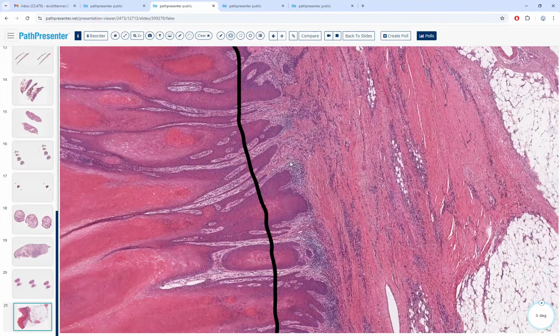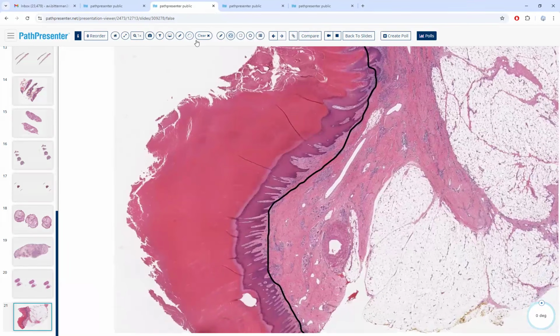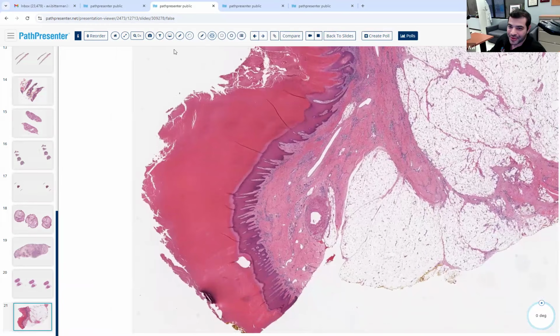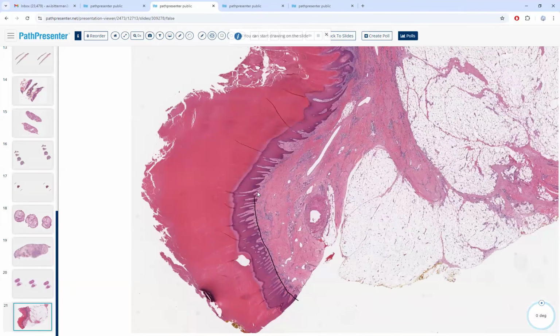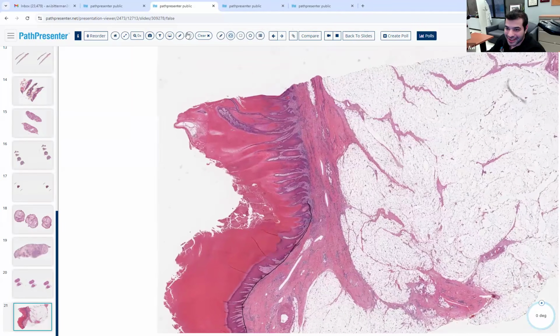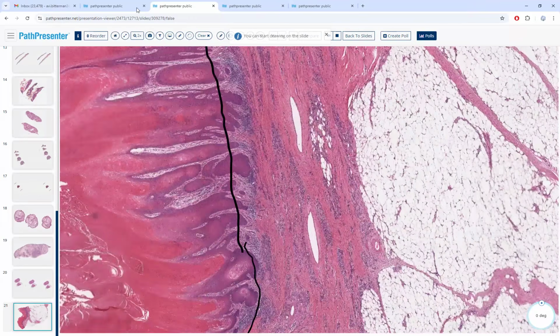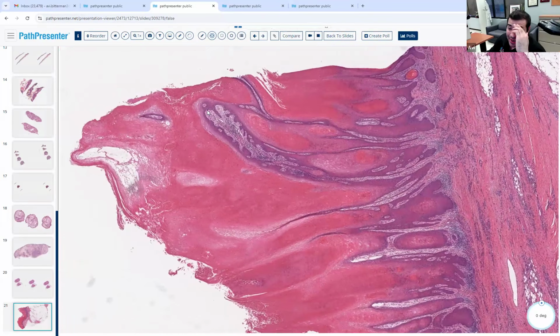Yeah, based on the line you drew, but how did you determine that was where the line should go? Well, I just followed it from the normal. Here's normal. We just kept the line going. If this is normal, it should be at this level, right? Then if I were to draw a straight line through, it should continue and it shouldn't be below that. I hear you. But look at how far they're starting up and how far they're going down.